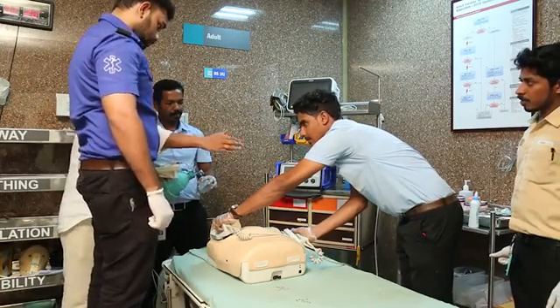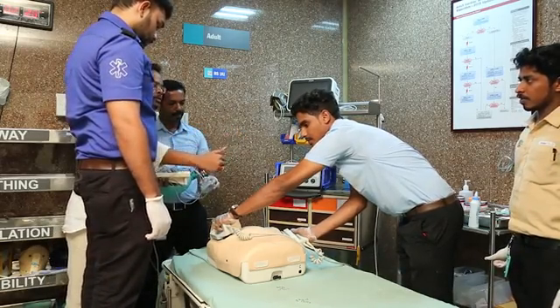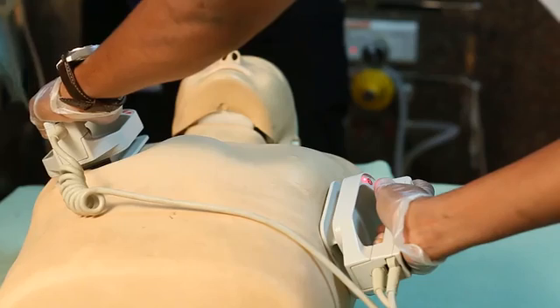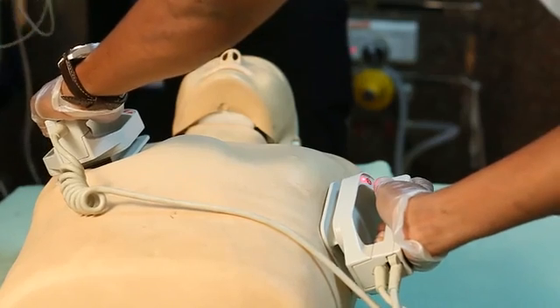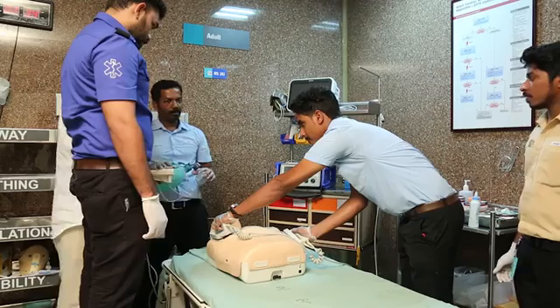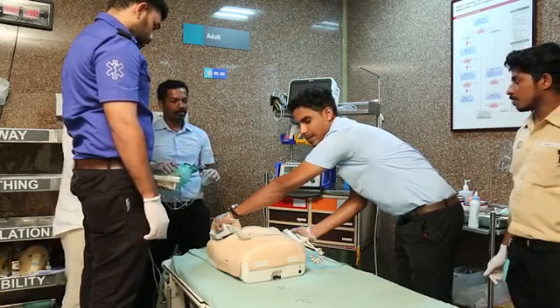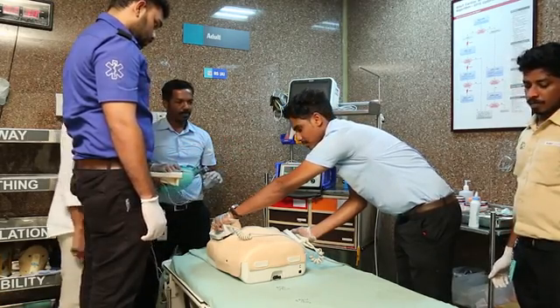Make sure that everyone is clear. The person performing defibrillation should be clear. The oxygen and the person ventilating must be cleared. All clear means everyone should be cleared.